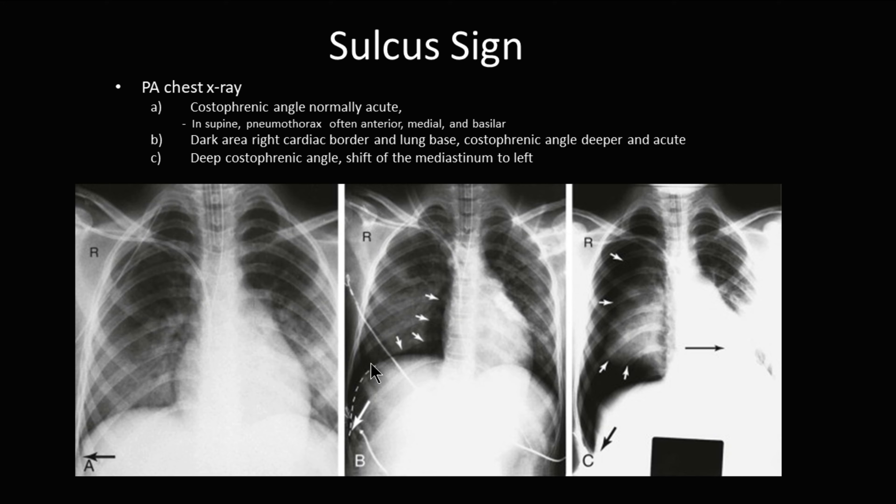This is the same patient. You can see the lung edge here and lung markings that don't go into this space. You see the costophrenic angle is widened more, the lung itself has started to collapse, and then you see a mediastinal shift to the left.